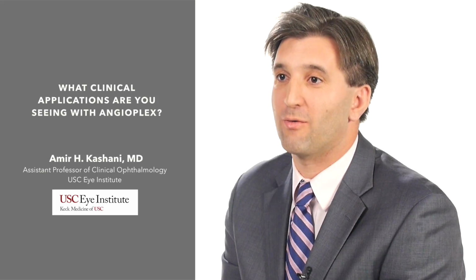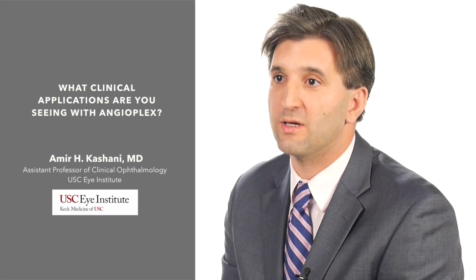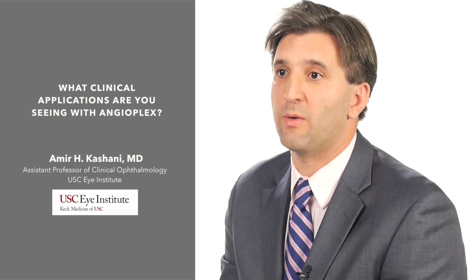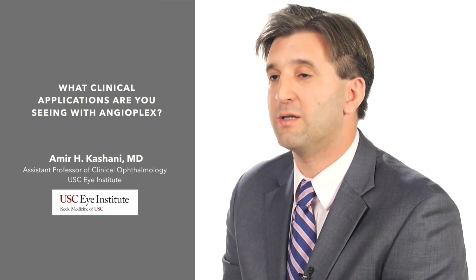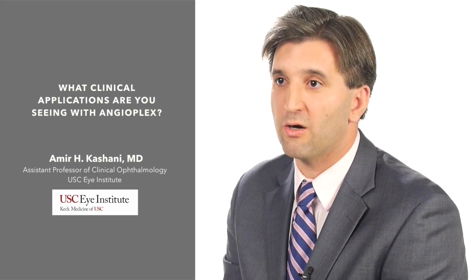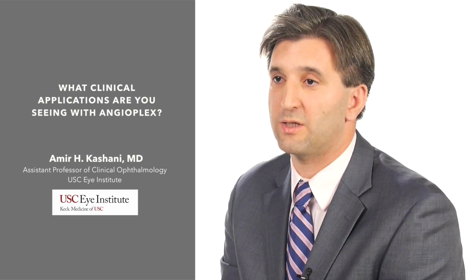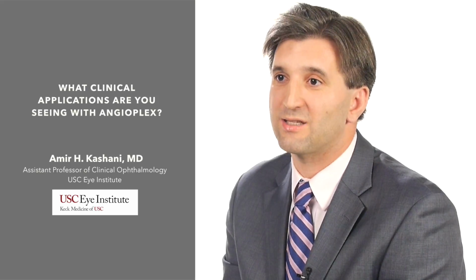So another example of where we can use Angioplex to look at retinal vascular diseases is retinal venous occlusions. Oftentimes patients with retinal vein occlusions will have an occluded vein that results in intraretinal hemorrhages and intraretinal edema, as well as macular ischemia. On fluorescein angiography, we need to do it repeatedly to be able to see where the macular ischemia is. But with OCT angiography, it'll be easy to follow the macular ischemia more regularly to see if the injections are improving or not improving the macular ischemia. And that's actually an important question in the field now, because we're not able to measure that as carefully as we'd like to.